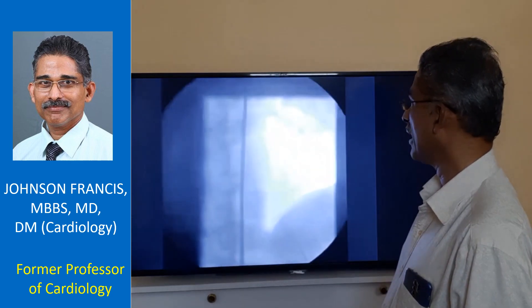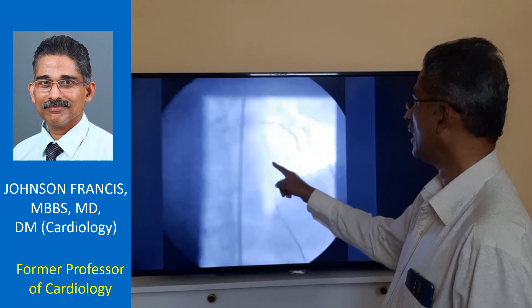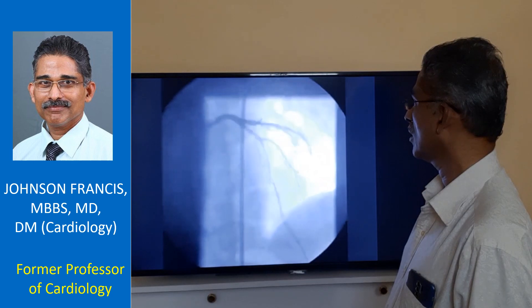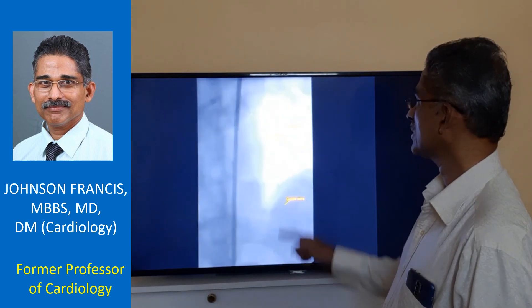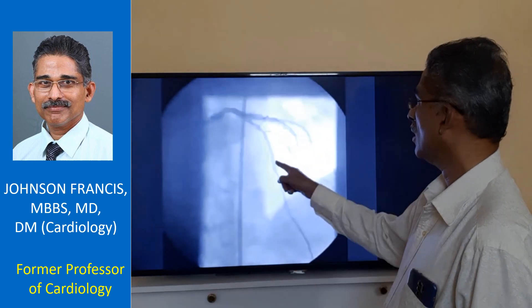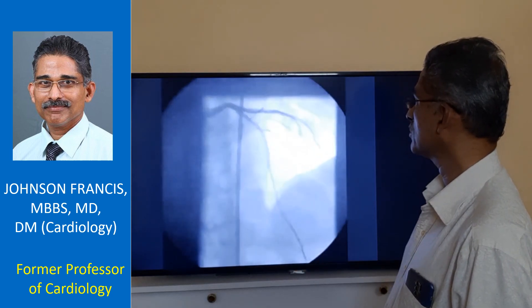This is the picture showing the guide wire alone. And the open segment can be seen here. One more check angio. And you can see the dilatation is better.